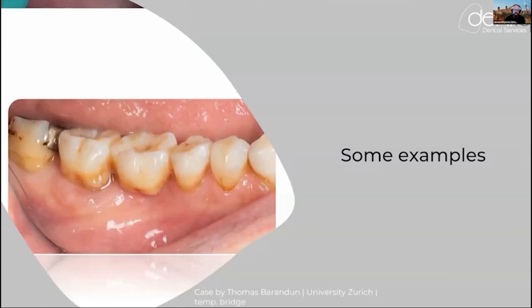This is a bridge that has been done by the university in Zurich. They made a temporary bridge. Well, if anyone says a temporary bridge, don't make them too beautiful, the patient is never coming back, by the way. So I have to give full credits to these guys. They've done an excellent job in making an absolutely aesthetic bridge.